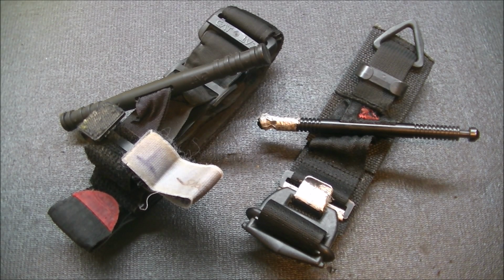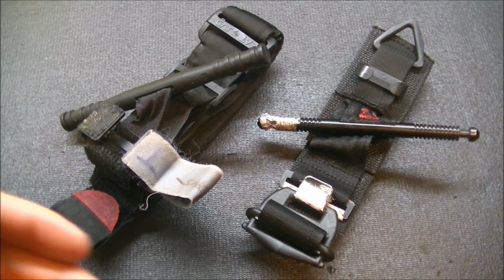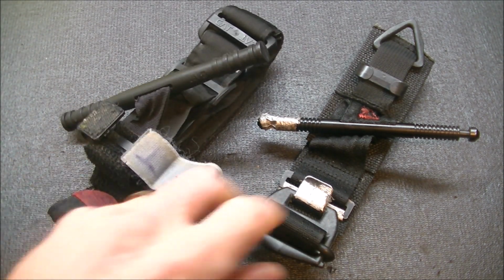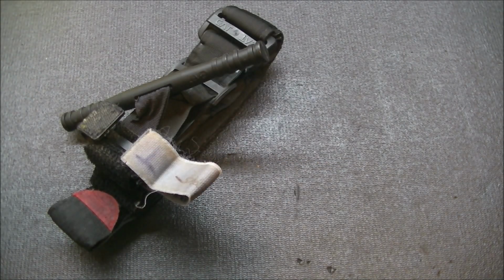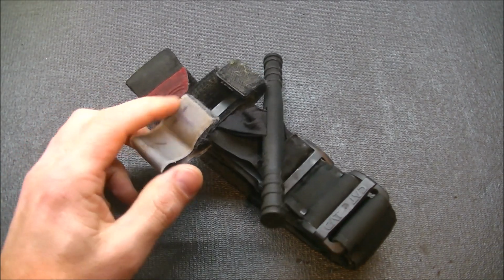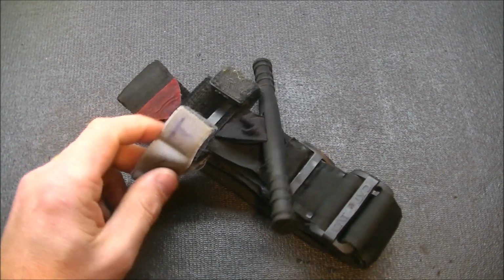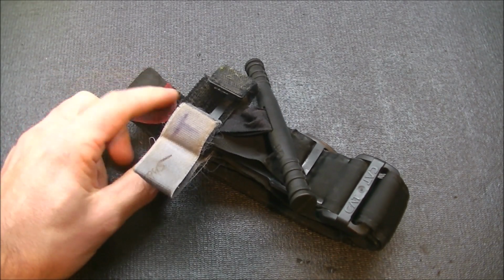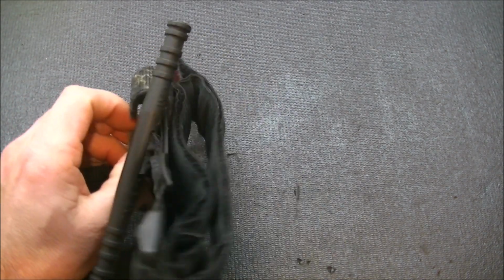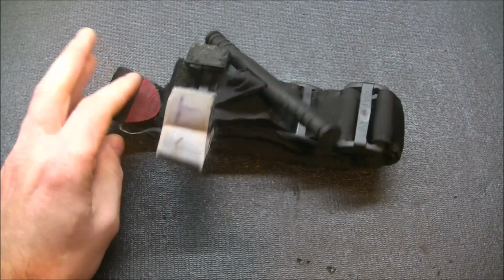But before we talk about that, let's go ahead and talk about the uses of each, the pros and cons rather. So let's start off with the CAT tourniquet. So I'll take my CAT out. Now this is obviously a training tourniquet because I have this marked T for training. And of course I've darkened this up a little bit so it's not so bright. And it's obviously been used a good amount.